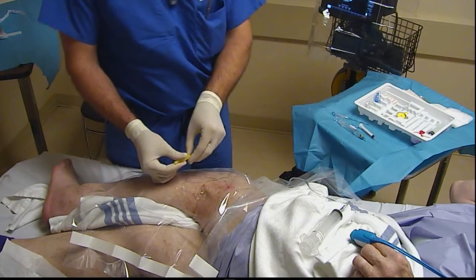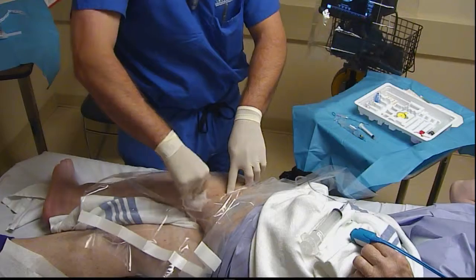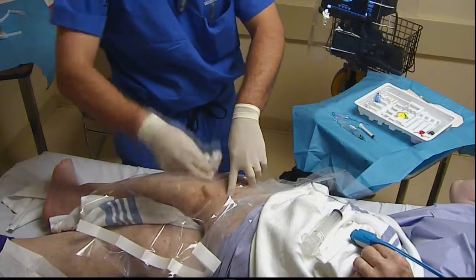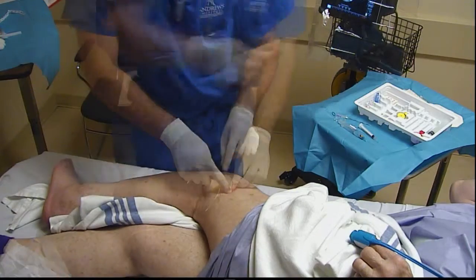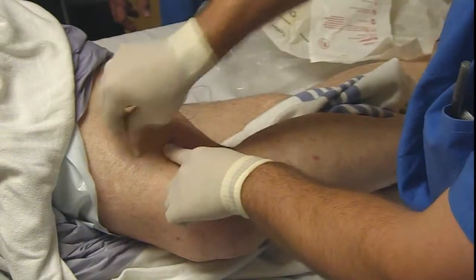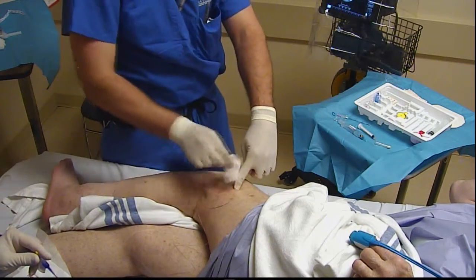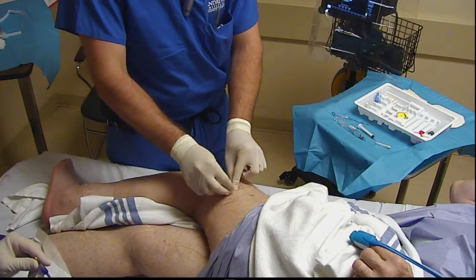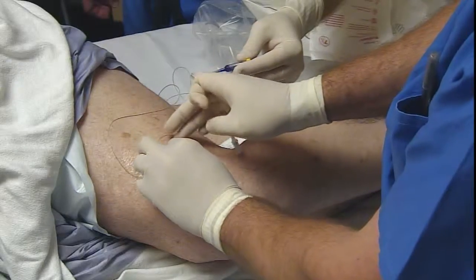We'll disconnect and do our usual securing technique with mastisol and histoacryl. First and foremost, make sure you get all that ultrasound gel wiped off. Using a mastisol bullet here — getting a nice wide prep with mastisol to approximate all the boundaries of the Tegaderm. After the mastisol, dab a couple of times with a sterile 4x4 just to accelerate the drying process — it makes it stickier quicker. Now I'll do a little Hickman pigtail here; catheter's about 14 or 15 cm at the skin. We'll use our sterile wand — our filter straw — as a spreading device for the histoacryl drops.